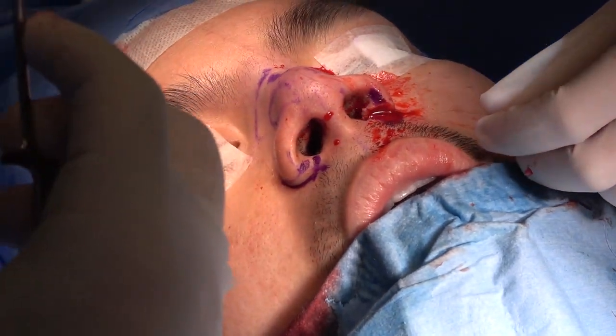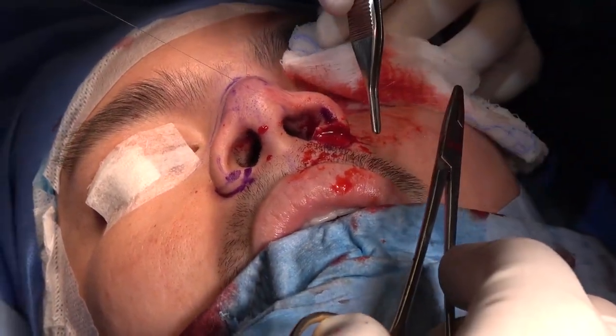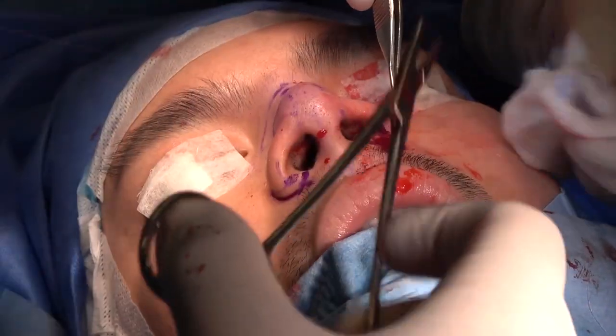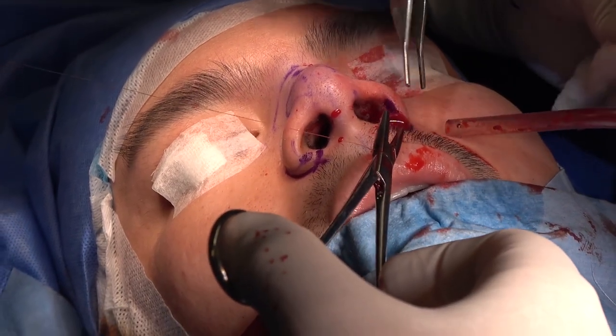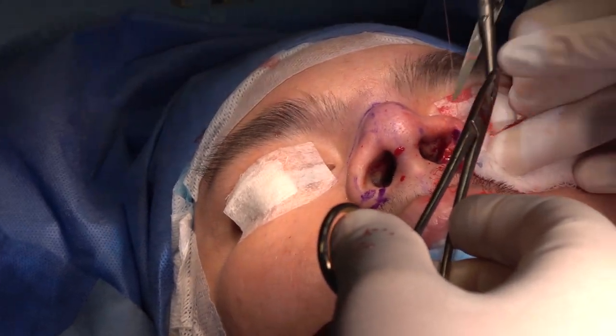Let the blood go to the side. Clean it, clean nicely. Okay, keep cleaning, keep suction.